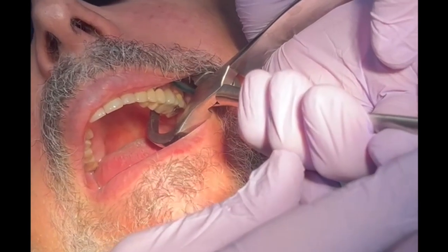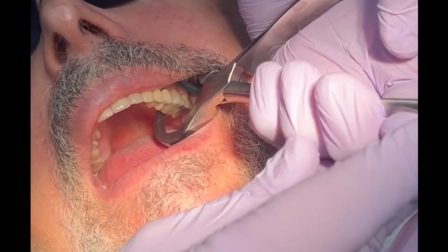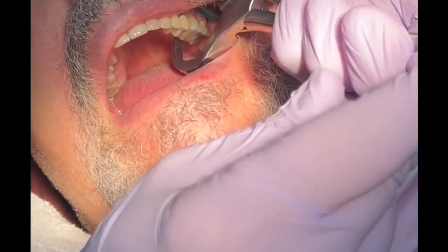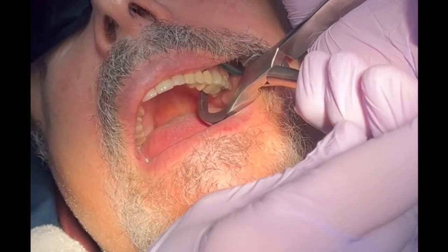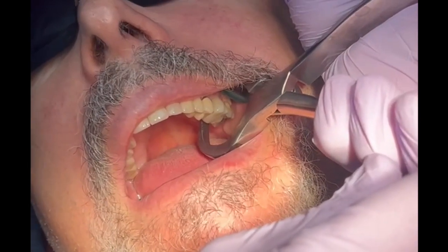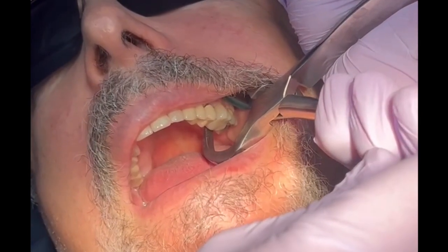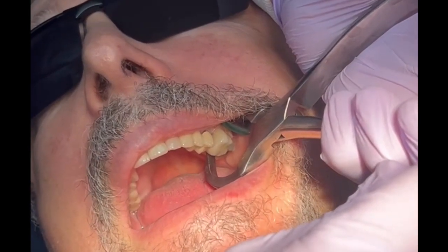Without squeezing the instrument whatsoever and no luxating, I'm simply rotating my wrist, and within a matter of seconds the tooth will pop. It's not intended to remove the tooth in total — rather, it's intended to luxate that tooth up and out of the socket following the arc of rotation.